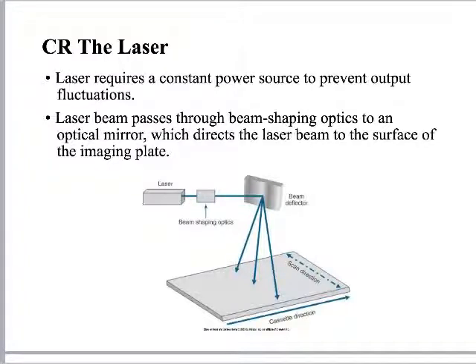So with the cassette, we have basically two scan directions. This is another thing that sometimes they test us on. We have a scan direction in which the cassette is moving through the reader. In this slide, it's called the cassette direction. Then we also have a laser scan direction, a totally different direction, pretty much perpendicular to the direction the cassette is moving through. You can almost think about it as similar to a CT scan, where the PSP plate is moving through the scanner, and the laser is the CT scanner scanning across it. So two different scan directions.